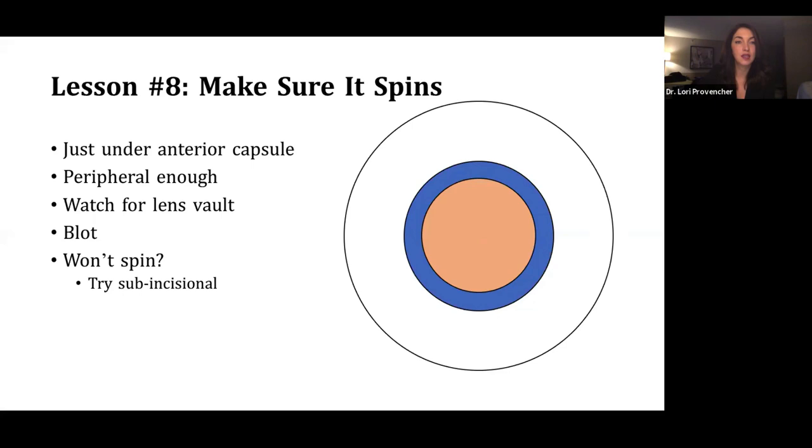Watch for lens vaults. If the lens is vaulting forward, that means that BSS is stuck behind the cataract, and if you keep pushing BSS, you're risking blowing out the posterior capsule. And so after you inject, blot down a little bit to keep your cataract back. And if it won't spin, try sub-incisional hydrodissection. What I mean by that is here, I'll show you some graphics.